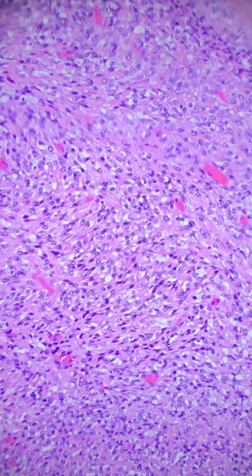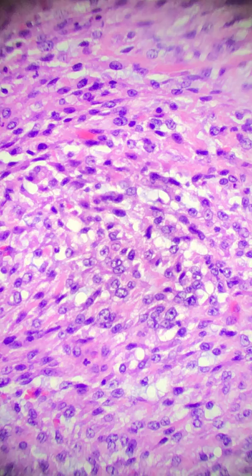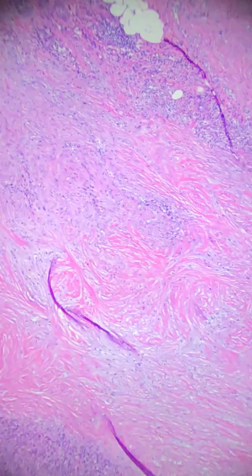We've gone over that the cells are atypical spindle cells. In this lesion, the pleomorphism is present, but they're not really wild cells, right? But as we like to say, are they potatoes or gourds? And we have some potatoes and some gourds, okay? So we have like a mixed salad going on in here a little bit. What you can see with these lesions is, if I drive around a little bit, this one's been around for a while, we have a little bit of hyalinization.